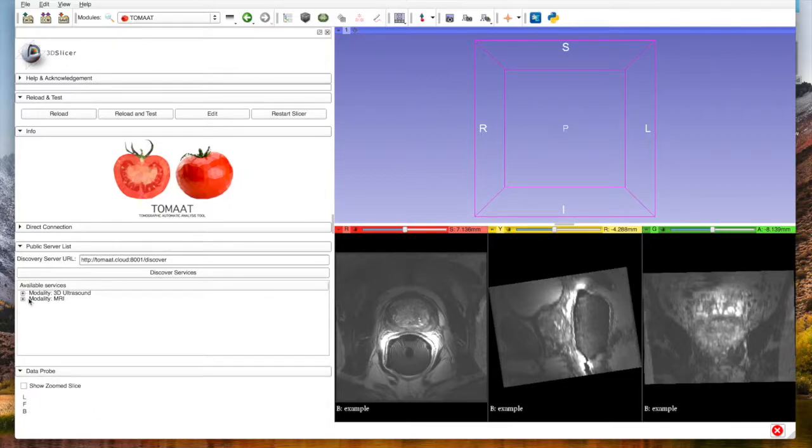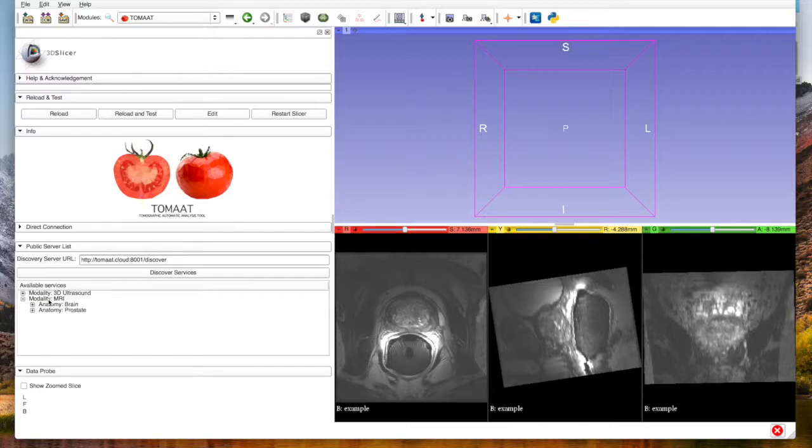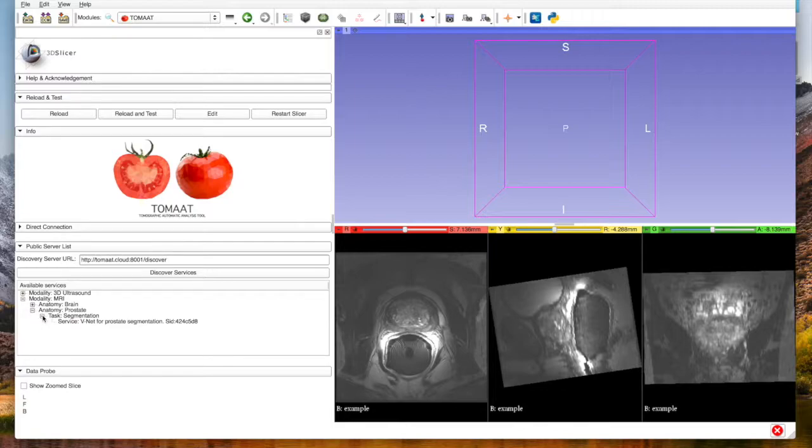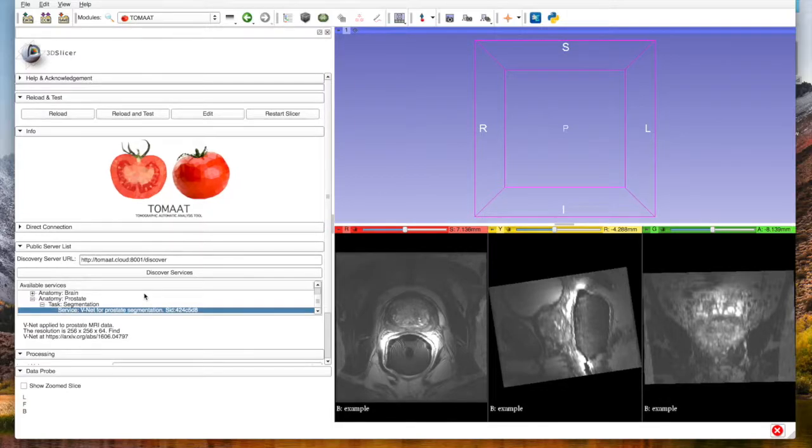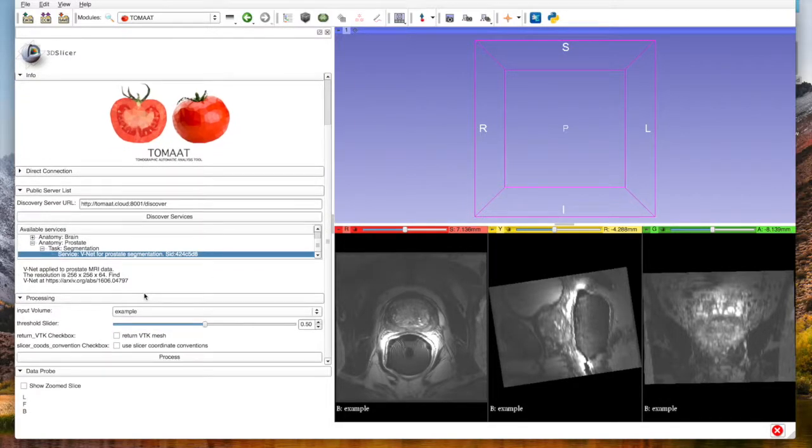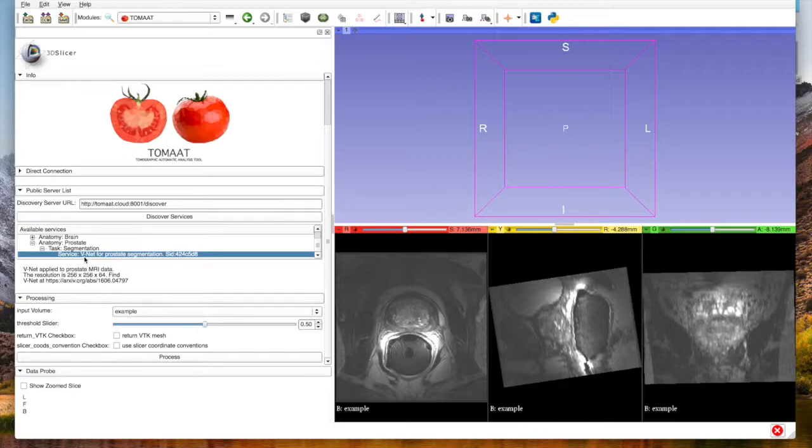We are presented with the available services pane, and we select the modality MRI, anatomy prostate, task segmentation, and then we select the service. At this point, we scroll a little bit down because the server has responded with its interface. It has built for us this user interface that we see here where we can specify input volume, threshold value, and other parameters.